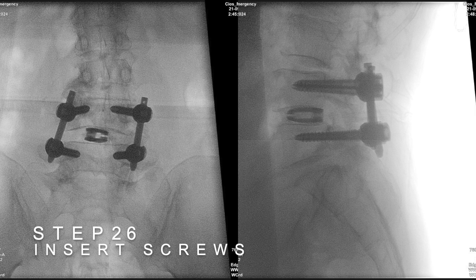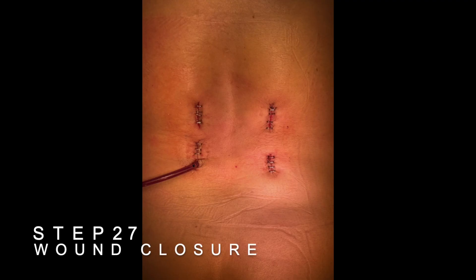Insert percutaneous transpedicular screws. Wound closure.